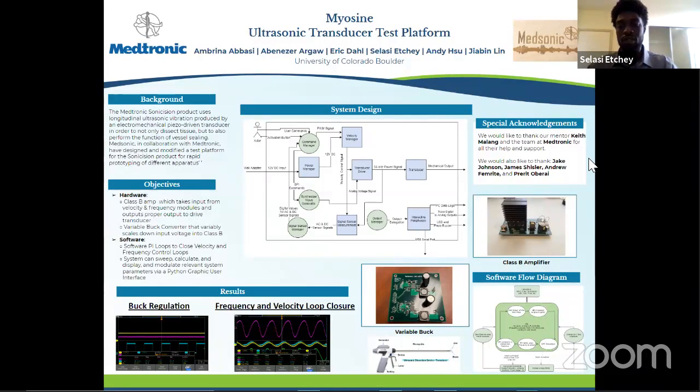One of the things that we also ran into were serial communication issues due to our baud rate slipping. One of the facets of our system was the ability to peek and prod and change system dynamics through the use of a Python GUI that we helped develop.